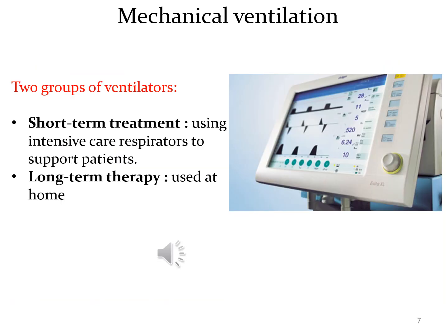For mechanical ventilation, the ventilator must fulfill three different tasks. 1. Oxygenation of the patient. 2. Partial or total assumption of respiratory work. 3. Monitoring of the device and patient.